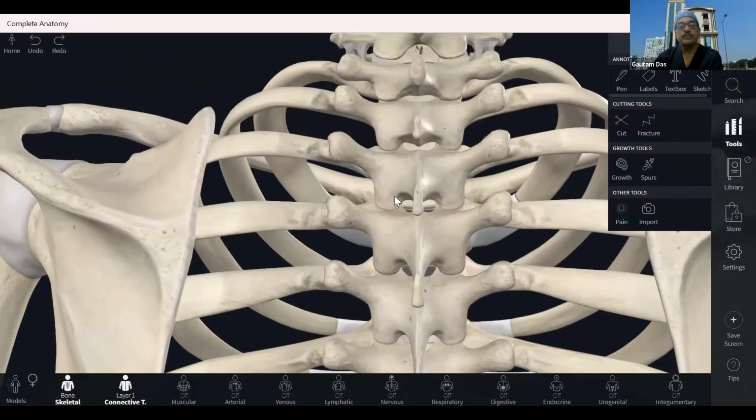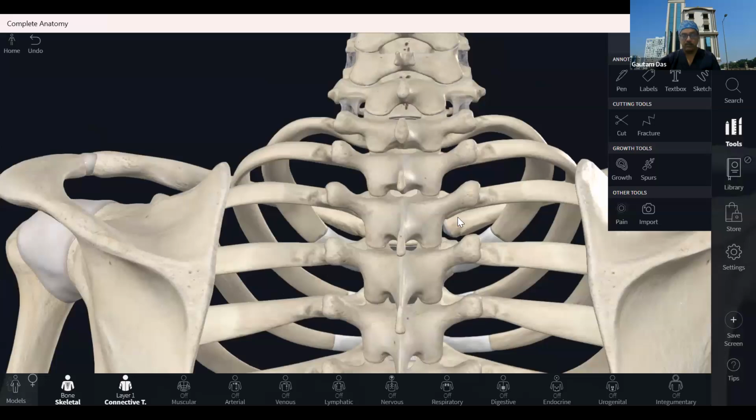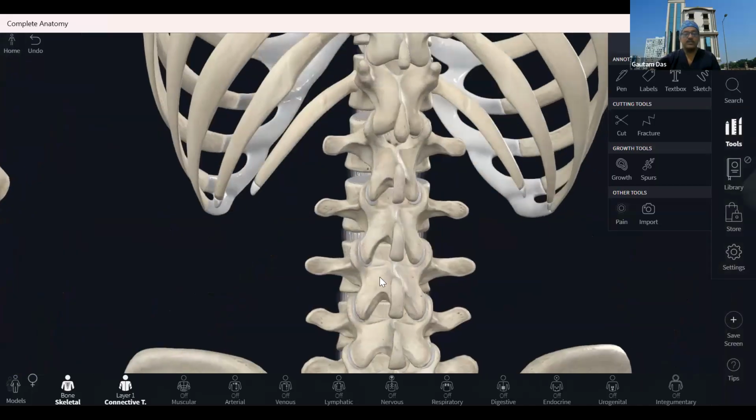Okay, so this is a little bit about the bony anatomy. Coming to the lumbar area, I'll be talking about that as well. In the lumbar area it is almost similar, but here the interlaminar gap is much more. You can easily find this interlaminar space, and you can go into the epidural space for injections easily. In the thoracic area it is difficult because the laminae are much more crowded.